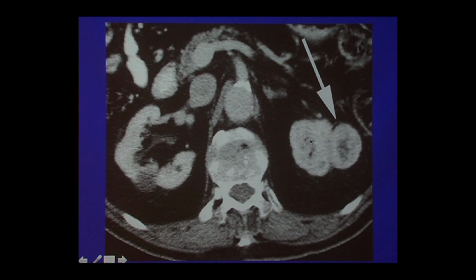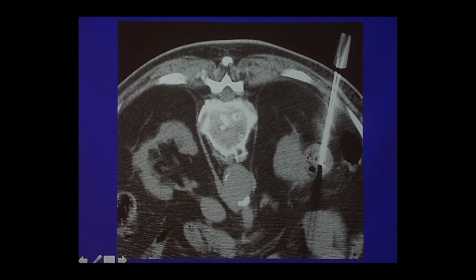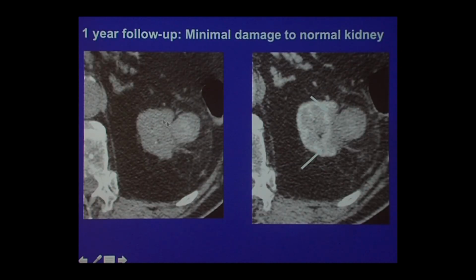Here's a tumor. That's the normal kidney. Here's the other kidney. That's a little cyst in that. But that's the kidney cancer. Here's the patient laying on their stomach. I've got the ablation probe in it, and I'm actually in the act of ablating this. And then this is a year later. And remember, we inject the X-ray dye to see if things are alive. Here, this is the tumor. It shrunk a little bit after the heating, a year later. And now we give the X-ray dye, and there is absolutely no blood flow to this tumor.